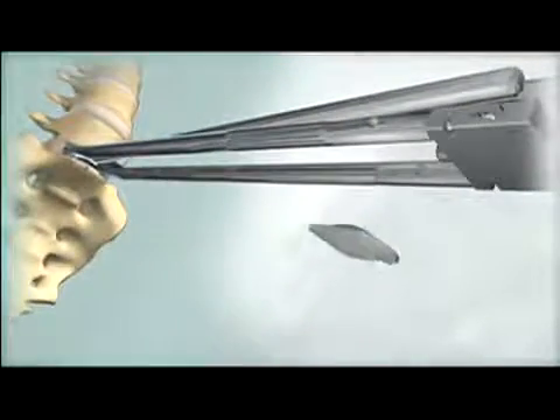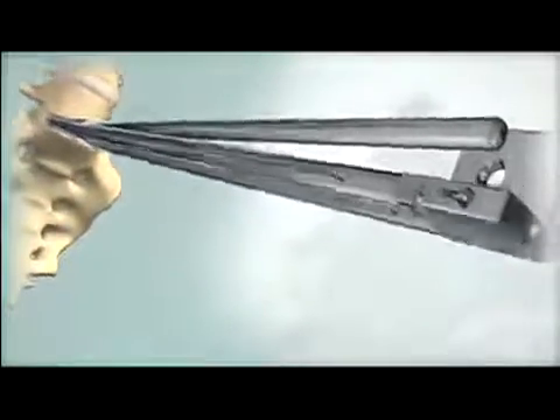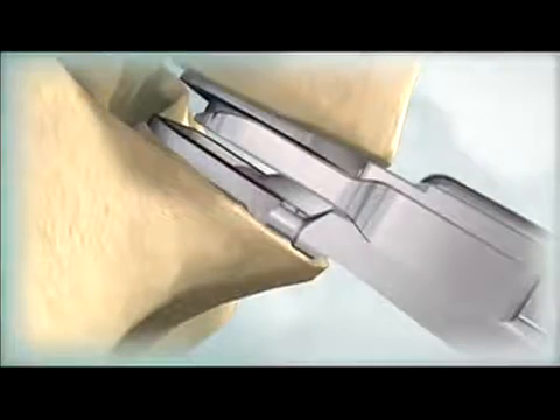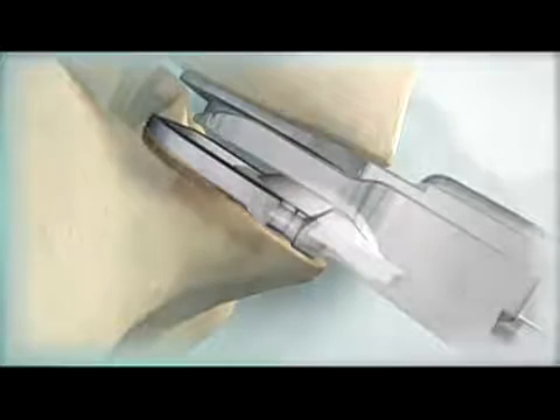Load the polyethylene inlay into the grooves in the inferior arms of the inserter. Assemble the distractor to the inserter. Use the thumbscrew to fully advance the distractor. Verify that the posterior edges of the end plates have separated from each other. Insert the inlay pusher into the grooves in the inferior arms, then manually push and lock the polyethylene inlay into the inferior end plate.